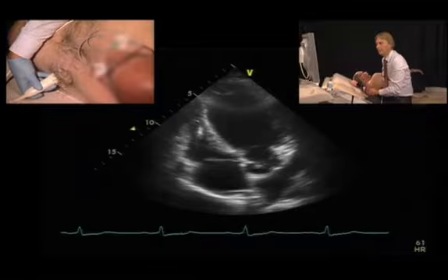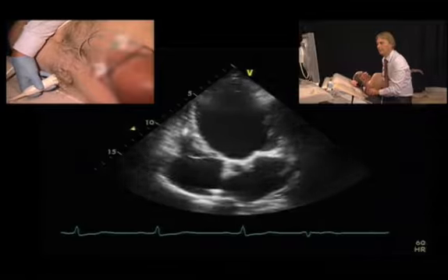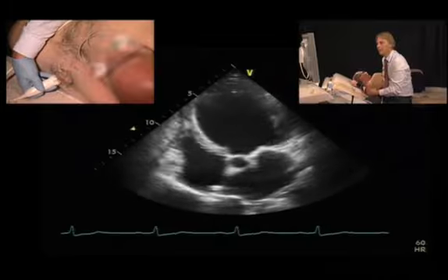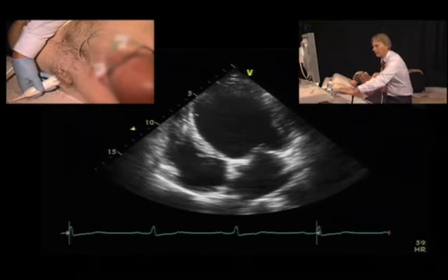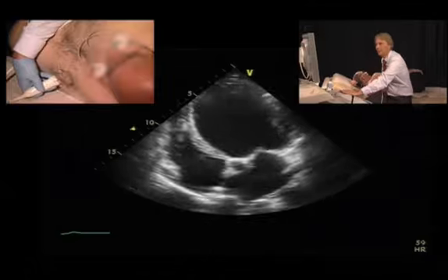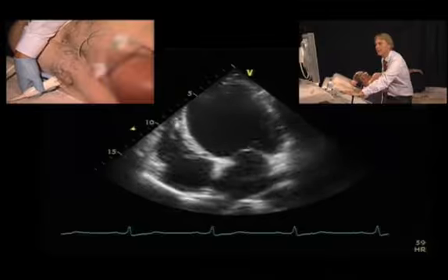and focus to the right ventricle. And you can nicely see that despite the very large left ventricle, the size of the right ventricle is fairly normal. It's actually almost smaller than normal. If we measure the diameter, 25 millimeters. So this is a completely normal right ventricular size.